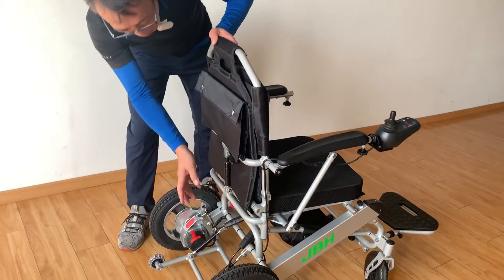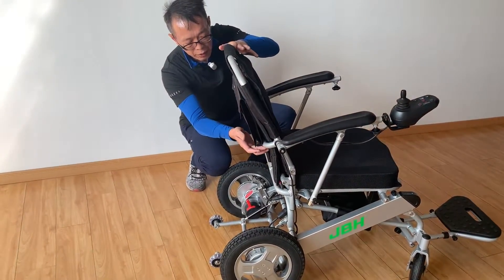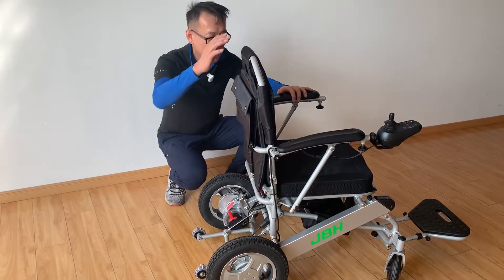Second, you can see from here we have a gas lift design — you can stop everywhere, or you can have a one-stop switch of the backrest angle.